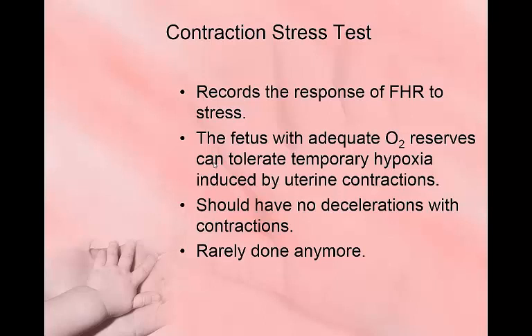This is part 2 of the Nursing 242 podcast on fetal monitoring. So in part 1, we talked about a reactive and non-reactive non-stress test. So now we're going to talk about something called a contraction stress test. You guys will probably rarely see these being done in practice anymore.